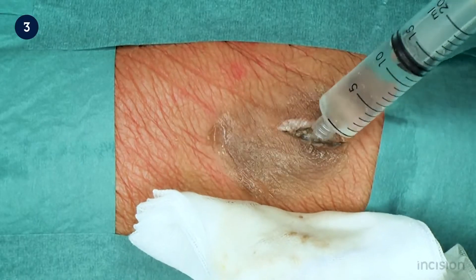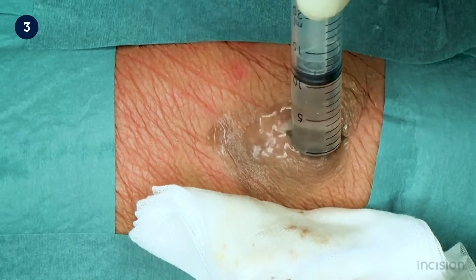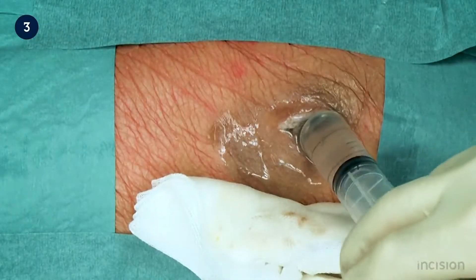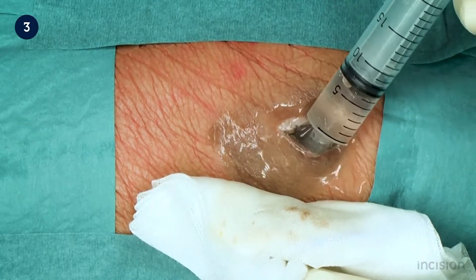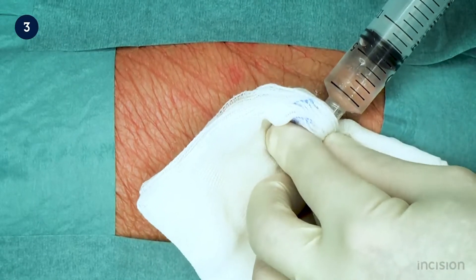The abscess cavity is then copiously irrigated using normal saline solution to ensure all debris and visible pus is removed.